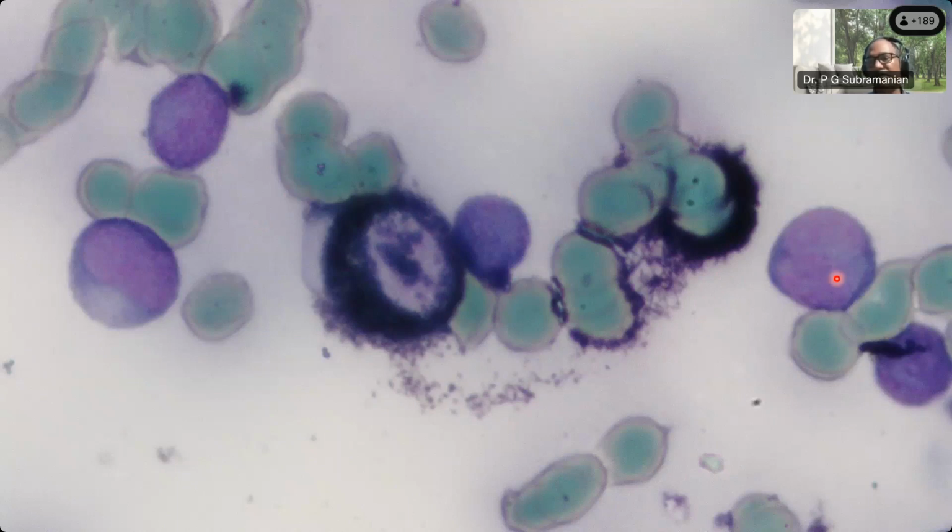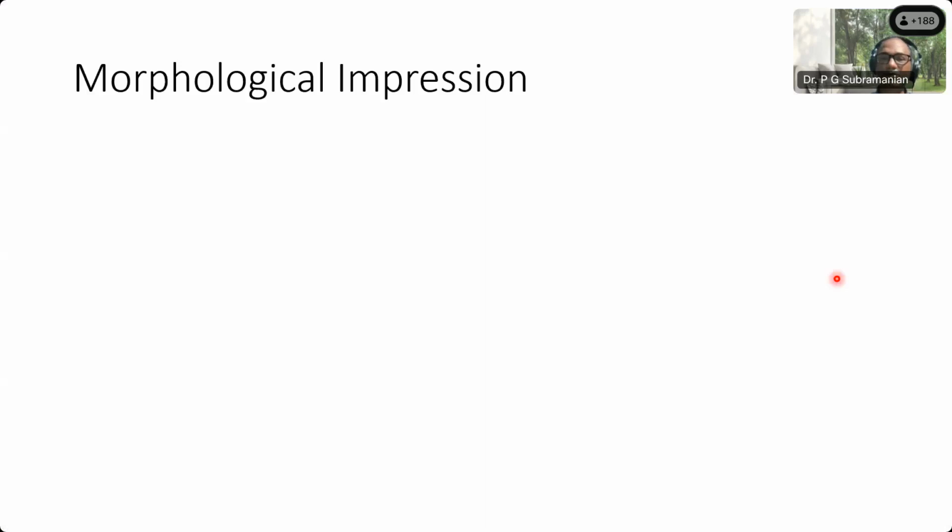So in this case, our MPO interpretation would be positive or negative? Negative. Okay. So the morphological impression at this end, based on this, what would be the morphological impression?